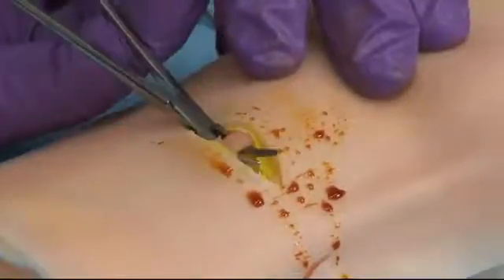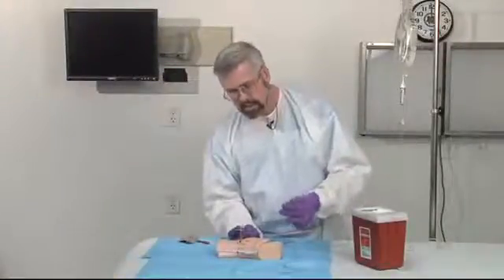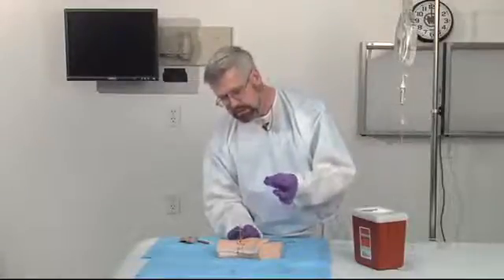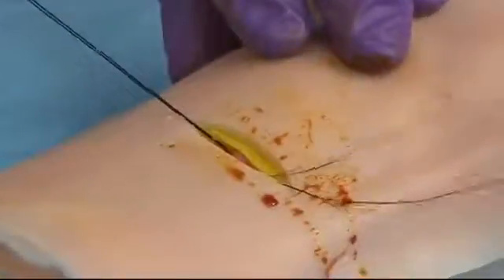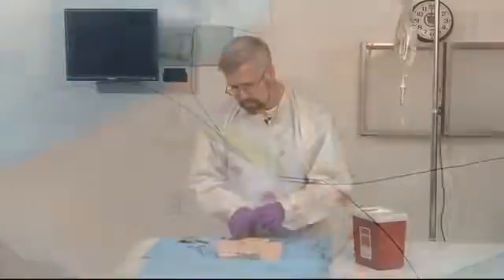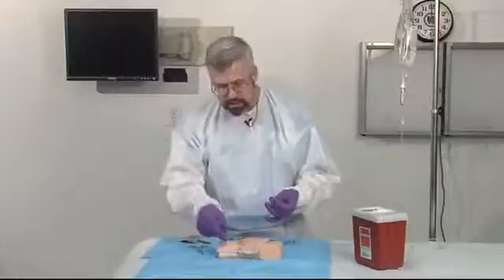Now I've got the vessel up, and the key here is you want to take a silk suture and actually pass it on either side of this vessel. One trick I like to use here is just to use one piece of silk folded in half, taking the center of that and pulling it through on both sides. Now I have this looped silk through — I'm going to cut it — and now what I have is essentially two pieces of silk, one above and one below.